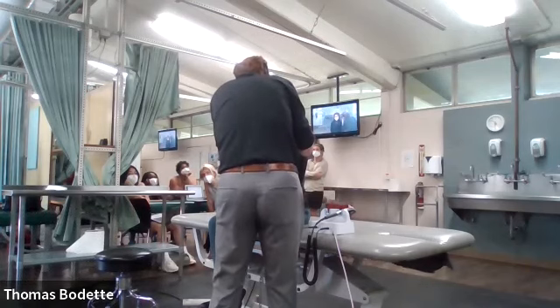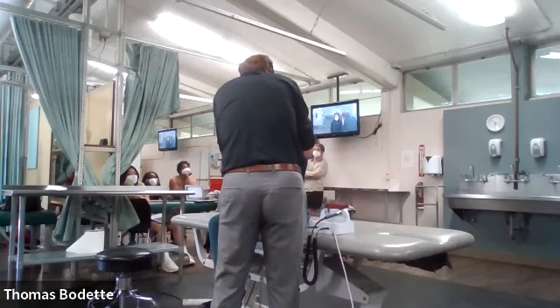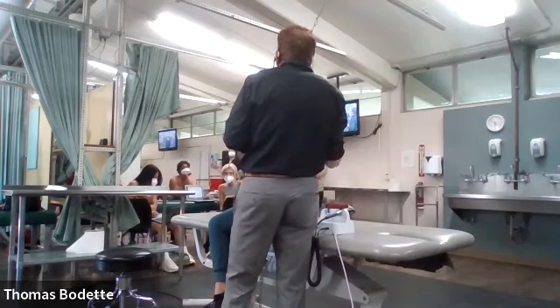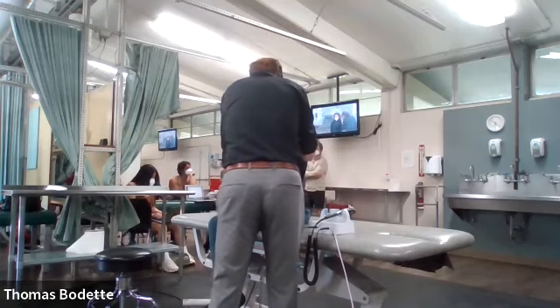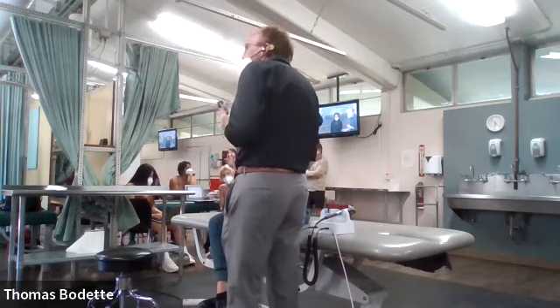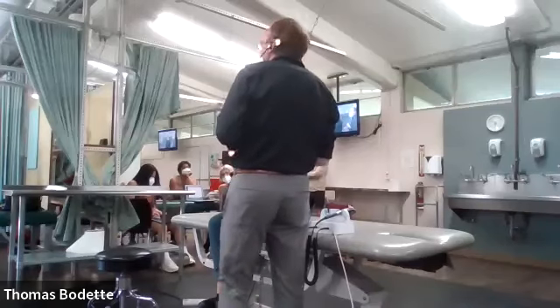So first step, what am I looking at? Red reflex first. If you can see the red, that's a good first step. If I don't see a red, what does that mean? Could be a nuclear cataract that I'd see on visual inspection, or it could be an eye prosthesis. Next step, you're going to work your way closer and you're going to refocus so that you can see an artery and a vein just pop. Pathologies associated with the arteries and veins are arteriovenous nicking, microaneurysms, hemorrhages, exudates.